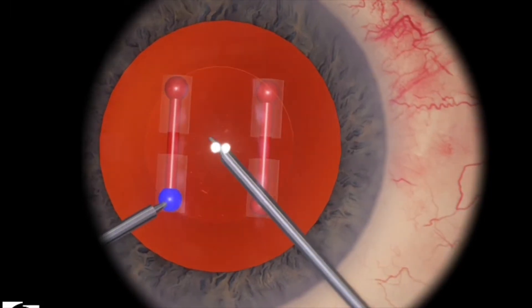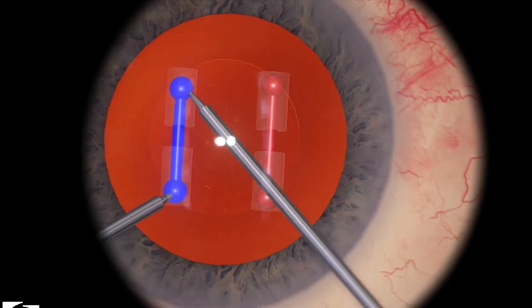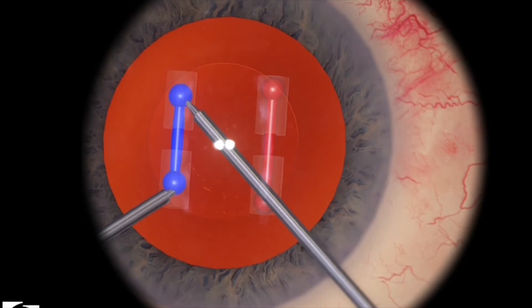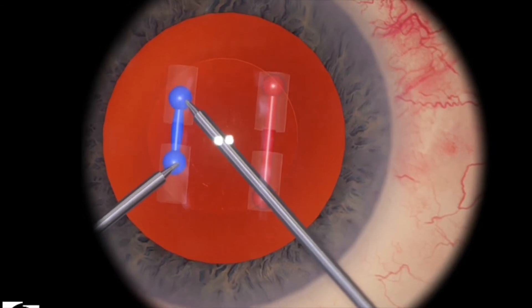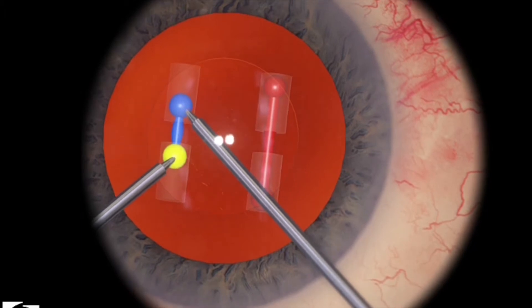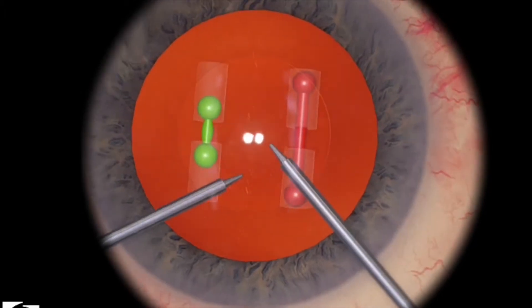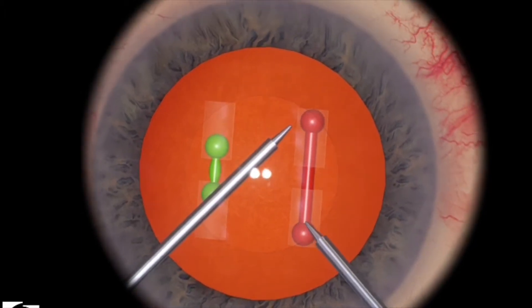In this particular level, your job is to move the opposing spheres together. Now, you have to be very slow and methodical, just like the Cataract B level. Make sure that your instrument tips are buried deep inside the sphere.